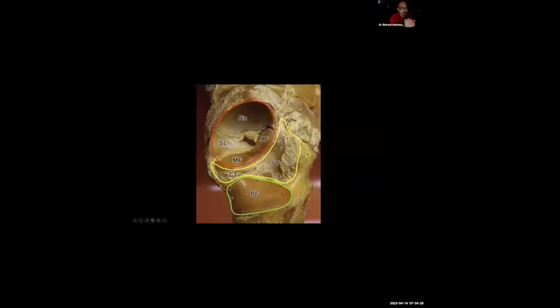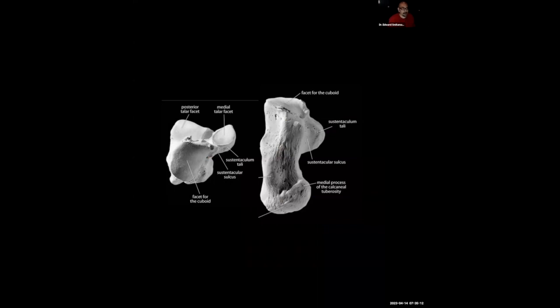Now, the anterior and middle facets are also important, right? They, along with the posterior articular surface of the navicular, in this cadaveric image shown here with the NA, that's the proximal navicular surface, along with the plantar calcaneonavicular, or that is the spring ligamentous complex, all combine together to form the acetabulum pedis, basically forming a cradle or a hammock supporting the talar head. Okay, so important structures at the plantar aspect of that hind foot.